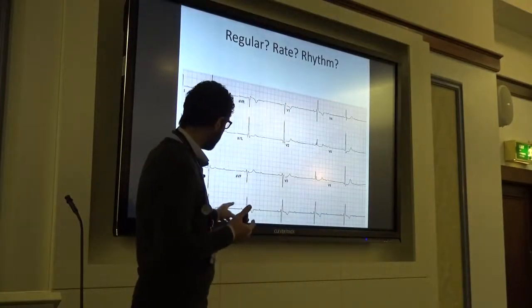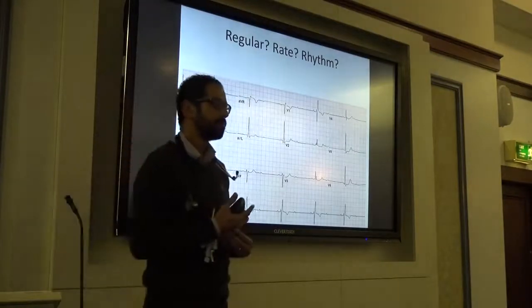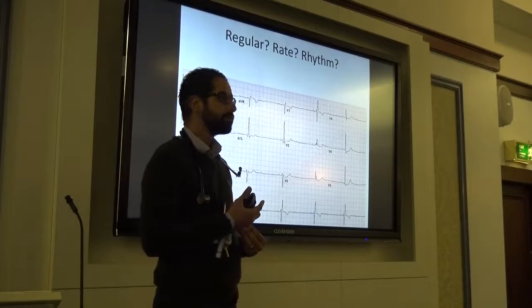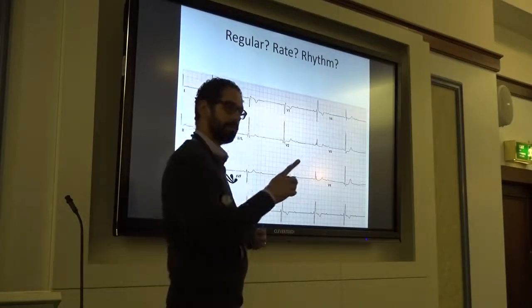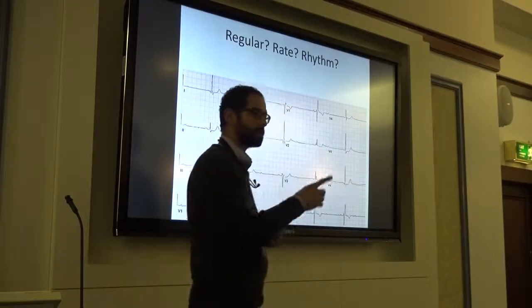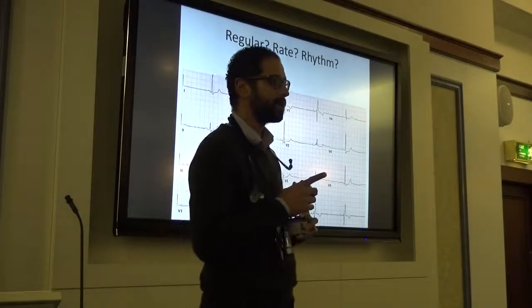So I can see PQRS, PQRS, PQRS, but what's happening here? So there's T-wave inversion, yeah. So keep your focus on the question. So what is happening here with the bradycardia? So the question is bradycardia. Why is this guy bradycardic?